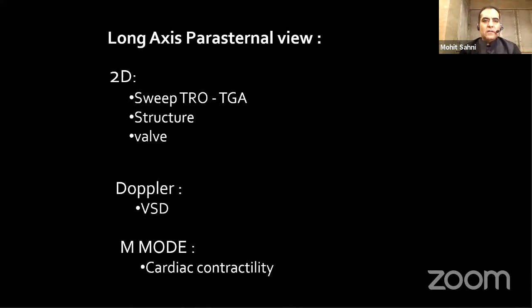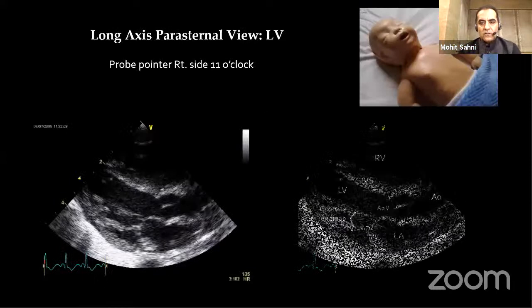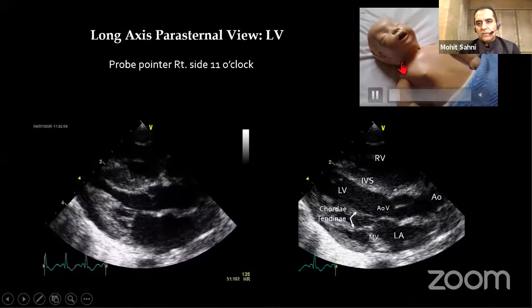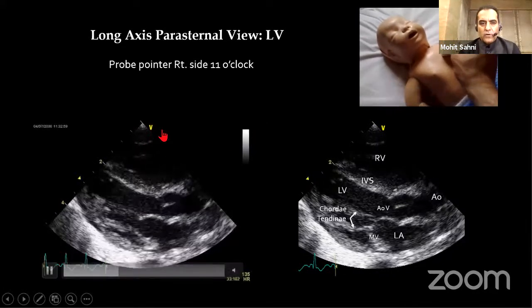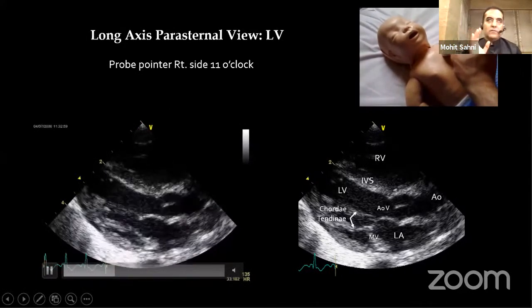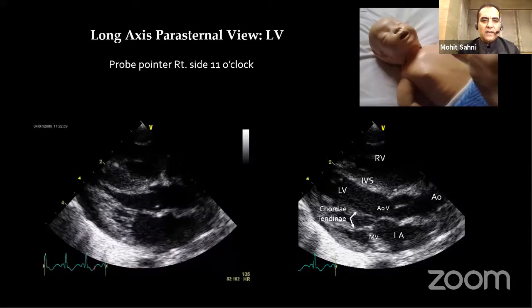And now the next thing is low parasternal views. In low parasternal, the first thing is the long axis, parasternal long axis view, plax view, what we call. So it is again at the nipple line. All these views are divided into 3 modes: 2D, Doppler, M mode. So you have to just learn and write down in the exams also like this. Now the pointer is pointing at 11 o'clock position towards the right shoulder at the nipple line. Now you can see the probe orientation marker is up. Only for the apical 4-chamber and 5-chamber, we keep this probe orientation marker down. For the rest, it is up.